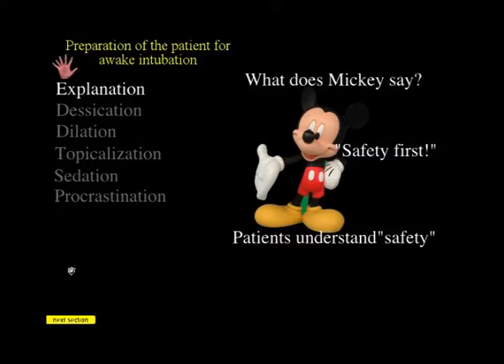In my entire career, 22 years, I've had one patient with normal cognition refuse awake intubation, and this was a buff, healthy, young firefighter, okay? The guy just would not accept it. But other patients, if you talk about it in terms of safety, they will accept it.